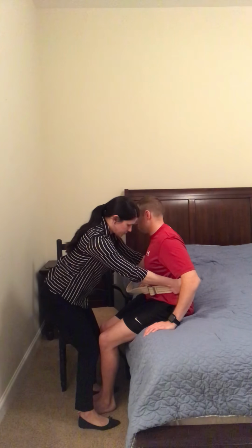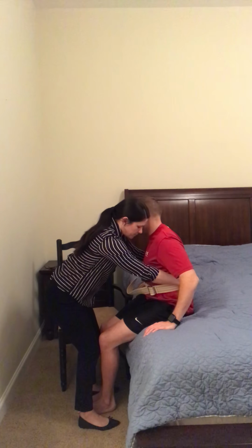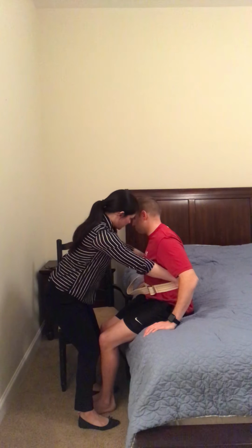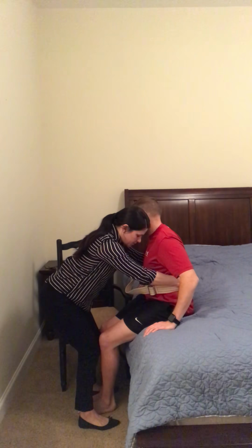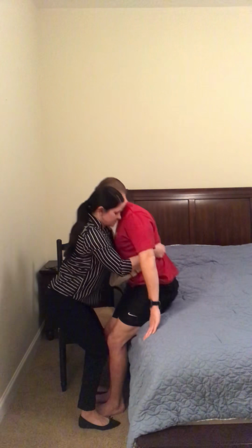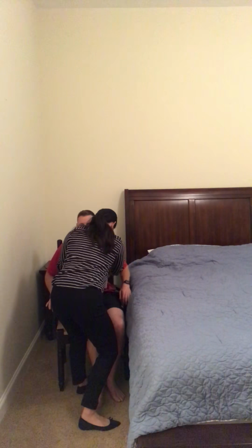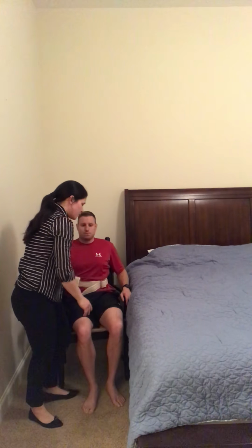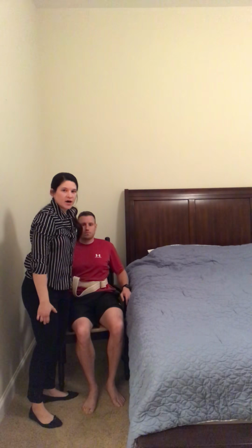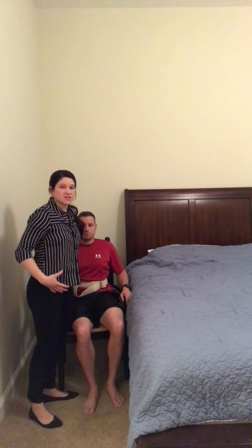Okay. So on the count of 3, I want you to push up, and then I'm going to pull you up and pivot you into the seat. All right. 1, 2, 3. Once the person is in the chair, you'll want to make sure that they're comfortable and in a good seated position.